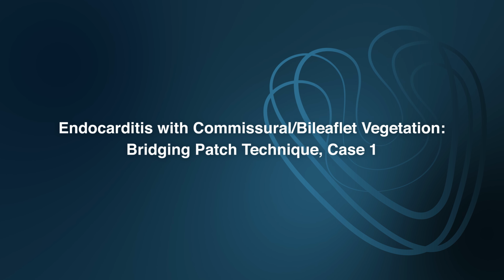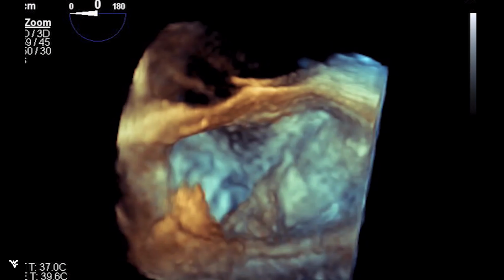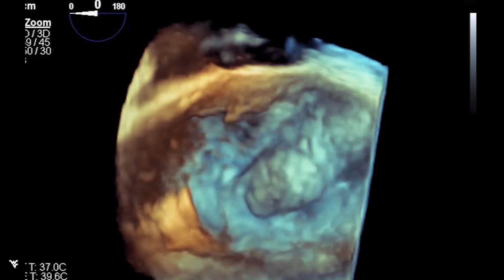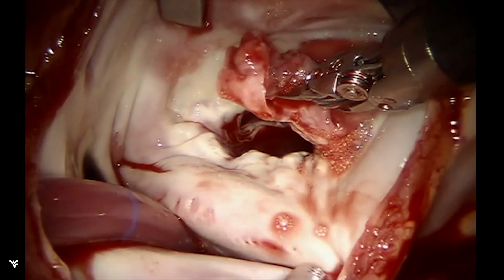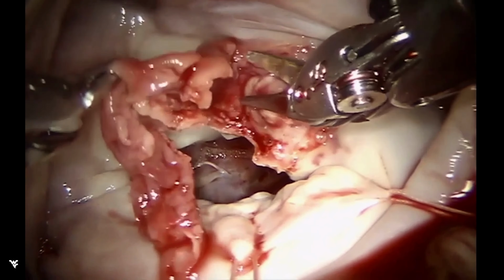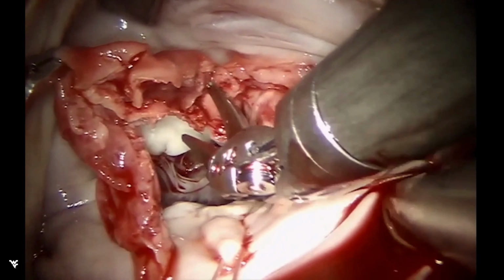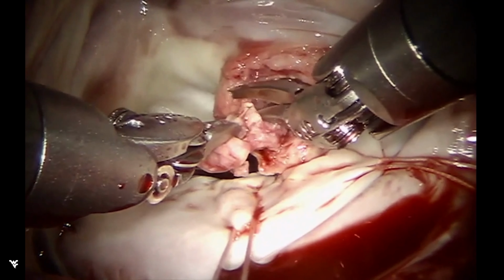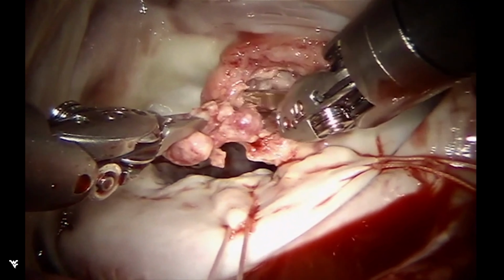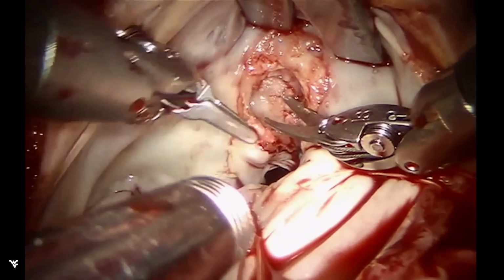Acute bacterial endocarditis can be a difficult and challenging situation to manage surgically. Robotic approaches are feasible, and this is a young, emaciated woman who presents with acute bacterial endocarditis and a cerebral infarction due to a septic emboli, in whom a sternotomy would be suboptimal. As you can see, there is an annular abscess.